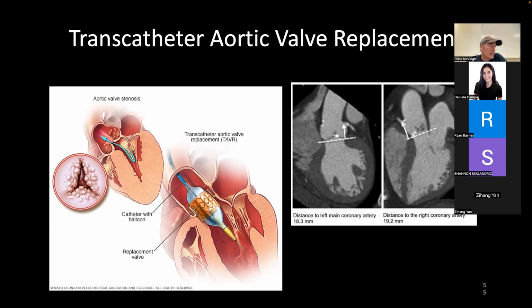And every manufacturer like Medtronic, Bard, all these people that make these devices also have experts who are good at that analysis. And the way they became experts is, in the early days of this, everybody had to ship their data back to their company, and the company would double-check. Even if you're doing your own analysis, the company would always do theirs. And then the cardiologist who's going to do the procedure used to have to look at both.